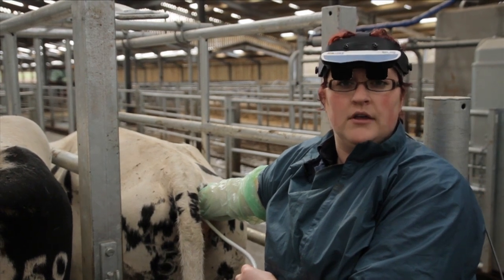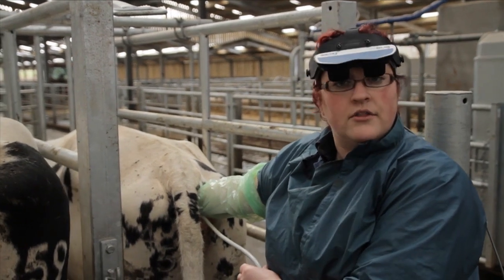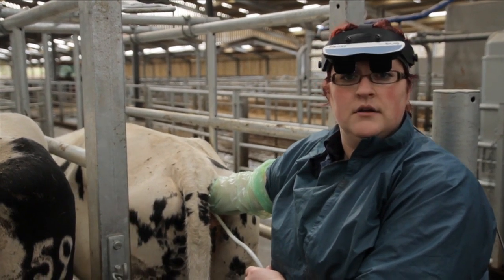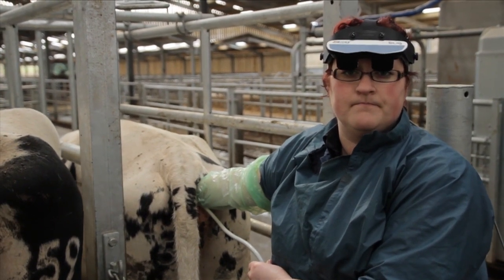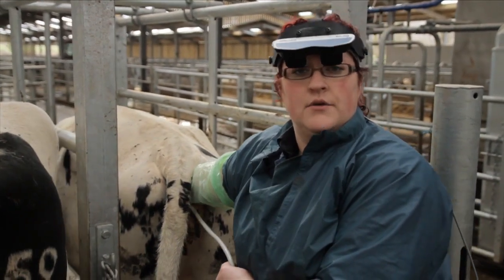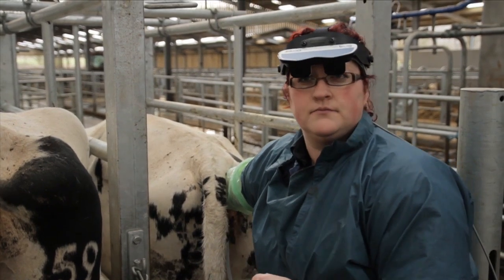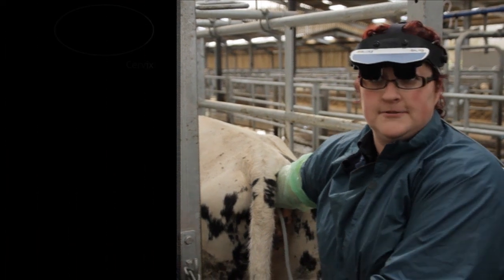If we then want to evaluate any structures further, so we wanted to have another look at the ovary or another look at the pregnancy, say if we're going to perform some fetal sexing of that fetus, then we can go back and evaluate that. But we want to ensure that we've seen all of the structures that we can when we're inside the cow. So what we'll now do is locate the cervix, which is a firm tubular structure leading down into the rest of the reproductive tract.